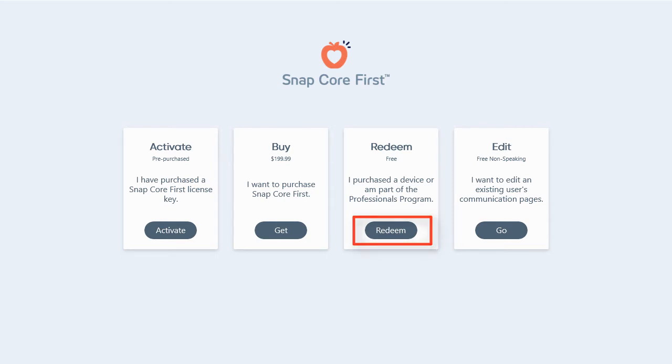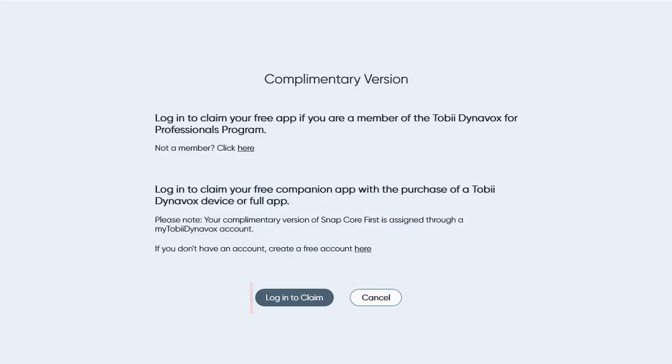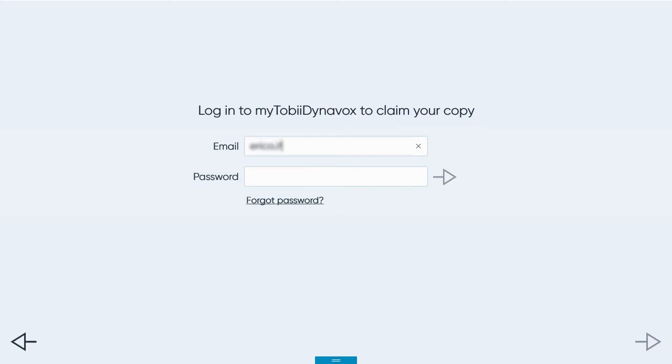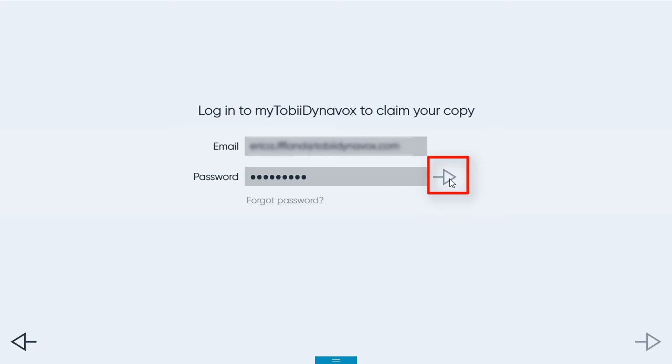Select Redeem. Select Login to Claim. Then input your MyTobiDynavox email and password. Then select the arrow to complete the remaining steps of the Setup Wizard.